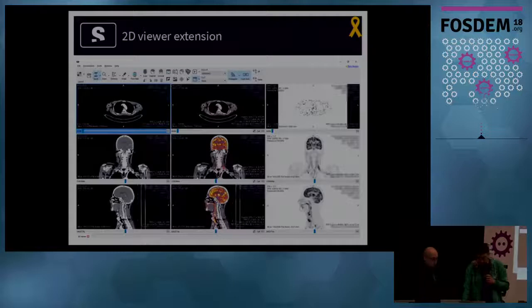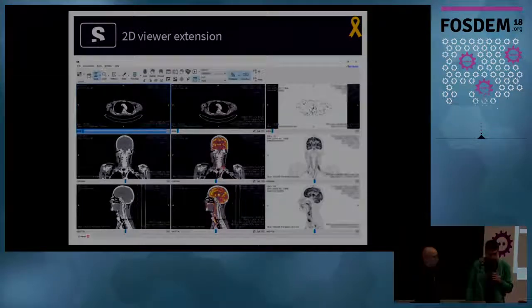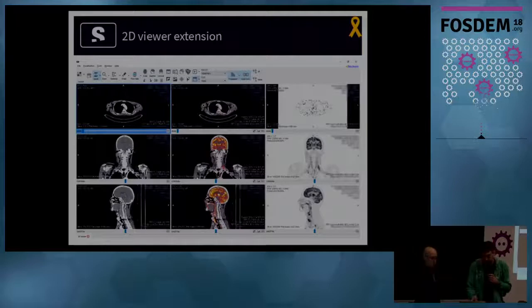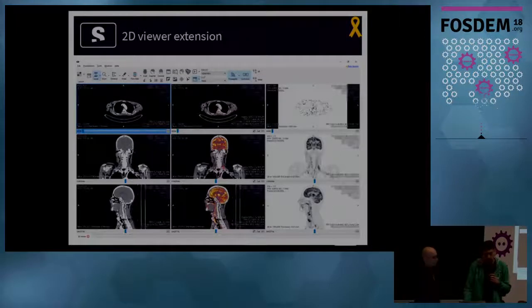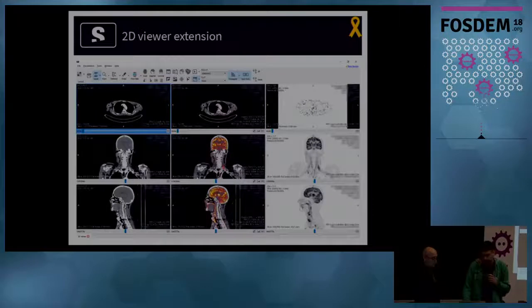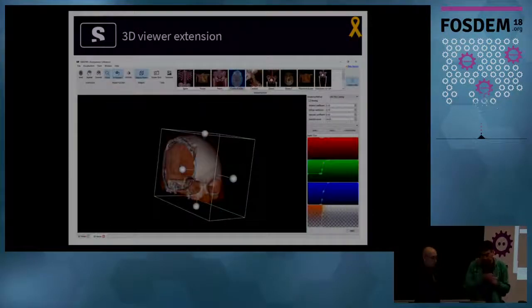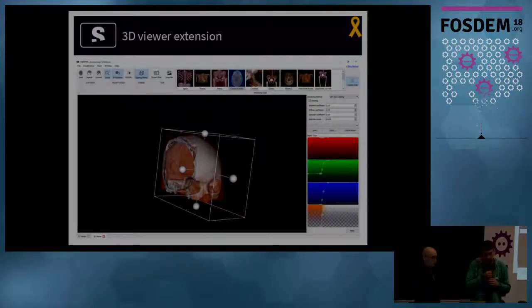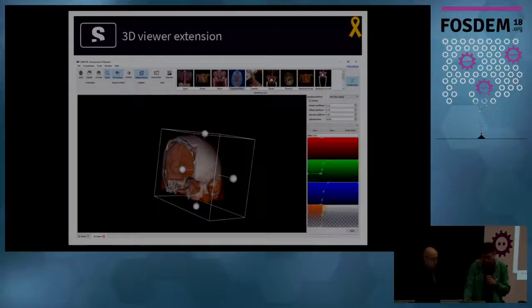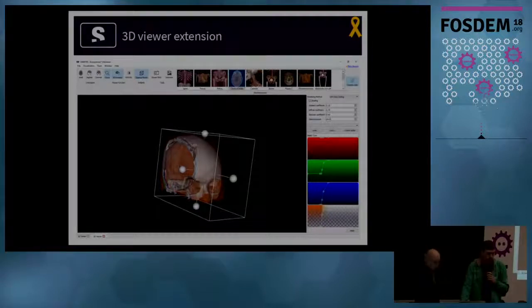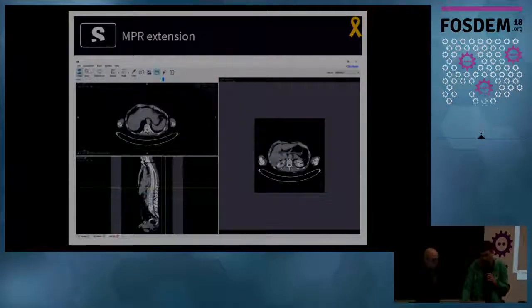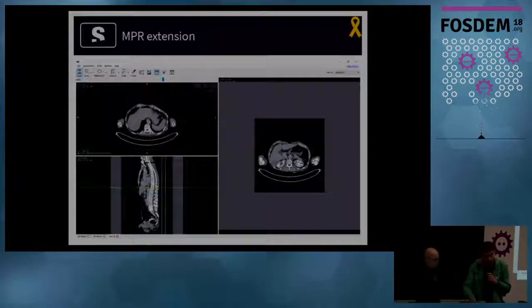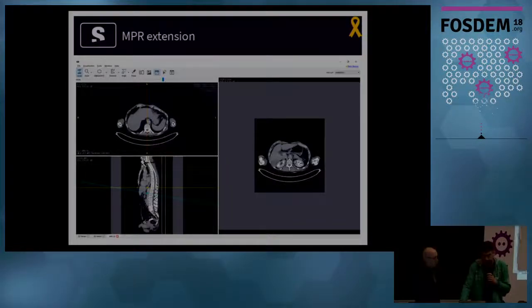Now we'll show you a few images of the extensions and later a demo. The most important one is the 2D viewer extension. It tells you to see images in two dimensions and implements image fusion. The 3D viewer extension allows you to view the image using volume raycasting or surface rendering. Both of them will be shown in a demo.